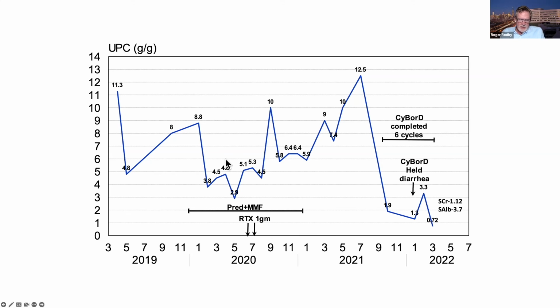This is an evolving disease, which we continue to learn about, and we've had a few of these cases so far, but they never cease to amaze me. And one of the take-home messages to me is, MPGN, it gets back to Dick's point, don't stop there. You can't stop there, unless there's a really obvious cause, or it's a TMA, like Bill said, where the immunofluorescence is negative, or just pure C3, where you think it's a C3GN or something. I think that even in C3GN you probably should do pronase to make sure that there's no evidence of monoclonal gammopathy, because those have even been described. So I think that's the point you were trying to make, right, Dick?